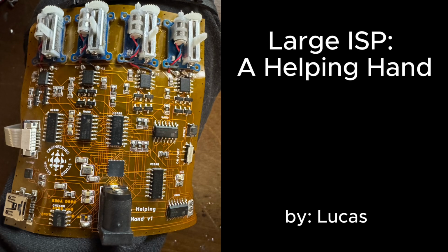This project's meant to enable spinal cord patients to be able to move their fingers again and be able to grab things to really improve their autonomy. First, I'll go over the many parts of the main PCB, which goes to the top of your hand, and how they work together to kind of control the helping hand. I'll then go over the touch sensor that goes in the palm of your hand and the exoskeletons on each finger.